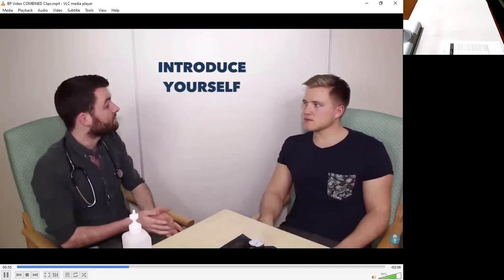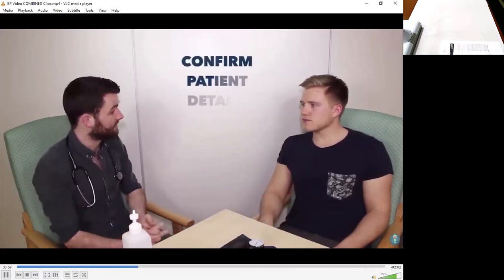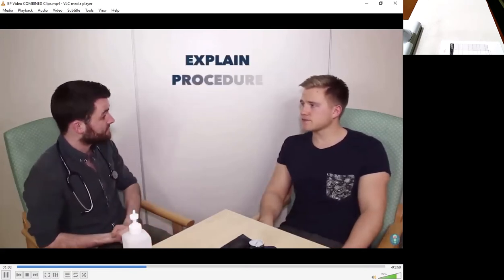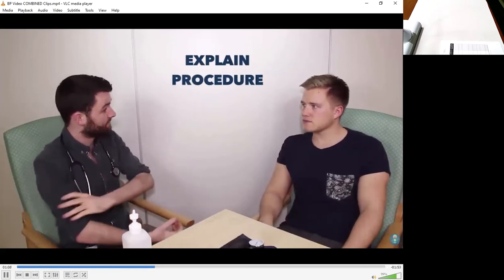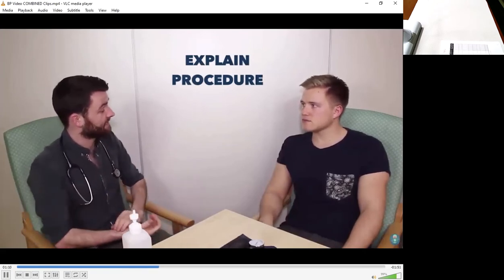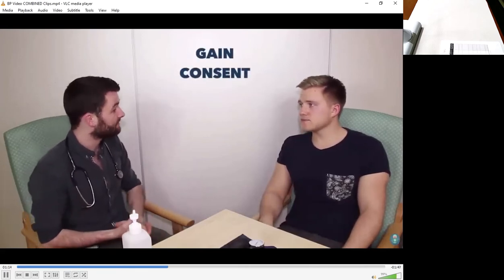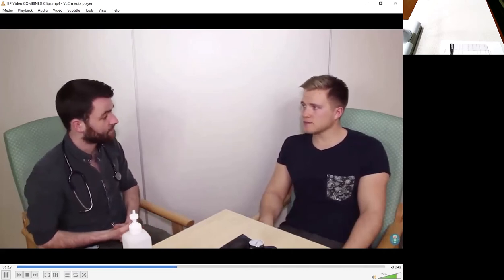Hi, my name's Simon. I'm one of the final year medical students. Can I just check your name and age, please? Yeah, my name's Andrew, I'm 25. Nice to meet you, Andrew. Today I'd like to take your blood pressure. So that will entail me taking this cuff, inflating it around your arm, feeling and listening to your pulse. Does that sound okay? Yeah, that's fine. It might be a little bit uncomfortable, but it shouldn't hurt. You okay for me to go ahead? Yeah. Lovely.